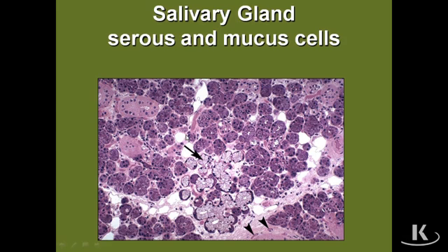It consists of an epithelium that's a combination of serous cells and mucous cells, and obviously there are different degrees of mucous and serous cells present in the three salivary glands. The parotid gland is a pure serous gland, whereas the submandibular and sublingual glands tend to be mixed glands. What you're looking at at the tip of the arrow are the lightly stained mucous cells. They typically don't stain well in H&E stains. The darkly stained cells that are adjacent are basically the serous cells, and they stain much more prominently with basophilic dyes in this histologic preparation.